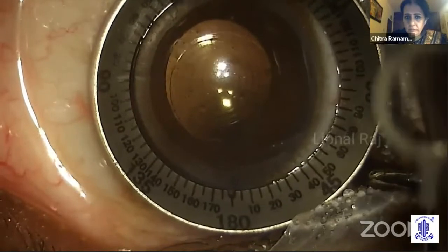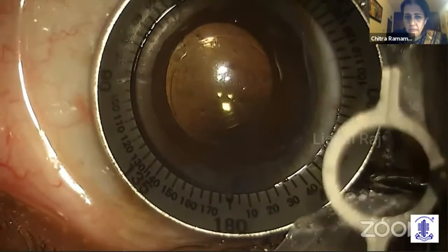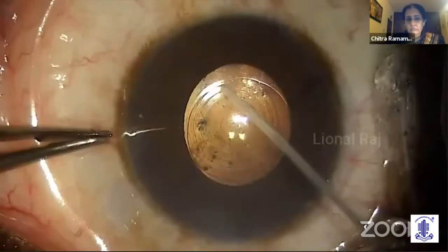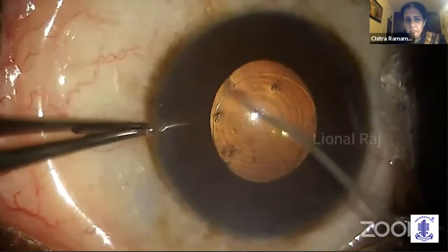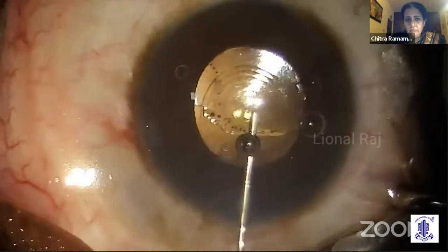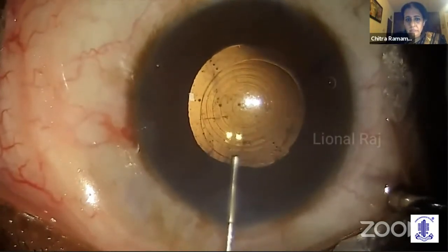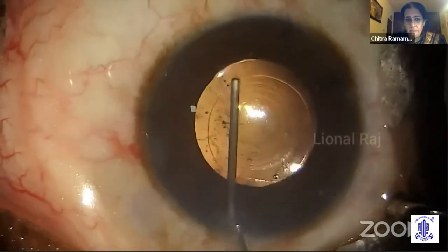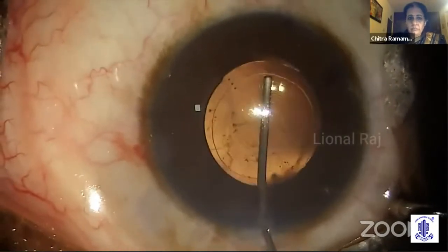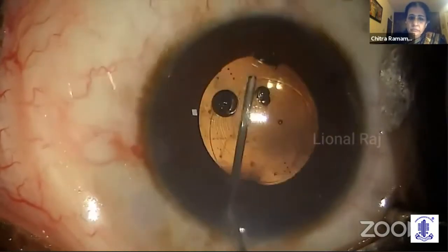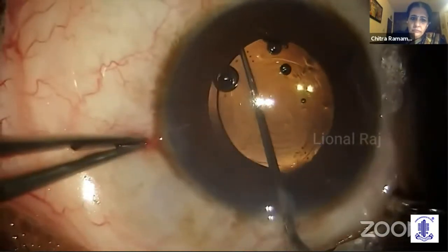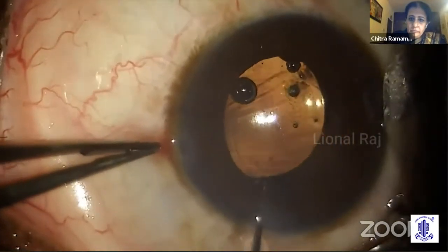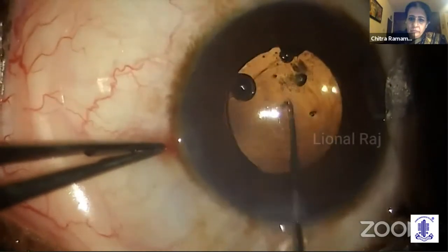The patient was taken back to the OR as early as day 3. The new axis of 136 degrees was marked manually. The incision and the bag were opened up very easily as they were fresh. With adequate OVD, the mobility of the IOL was ensured. After sufficiently filling the anterior chamber and the bag with OVD, the IOL was gently rotated to the new desired position of 136 degrees with maximal ease.